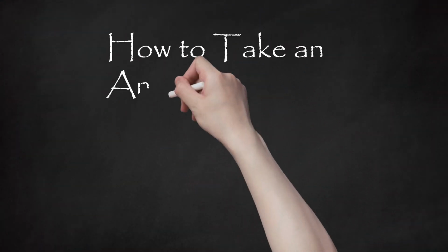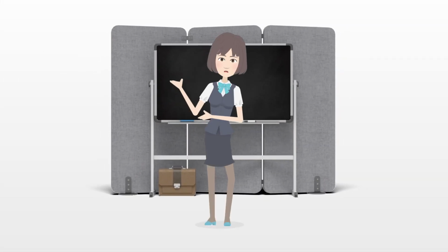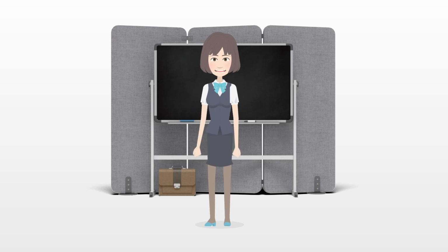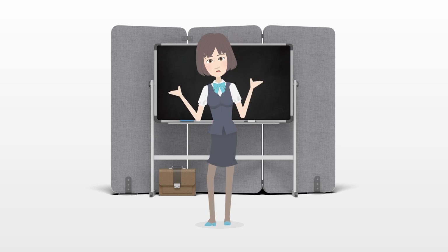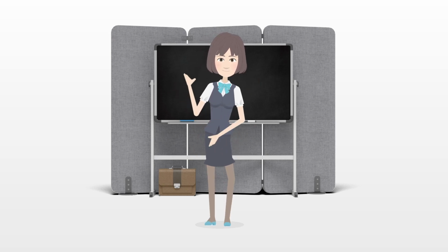How to take an ankle brachial index. The ankle brachial index, ABI, is the ratio of the blood pressure in the lower leg or ankle to the blood pressure in the arm. Knowing the ABI is important because it can be used as an indicator of peripheral arterial disease, PAD.